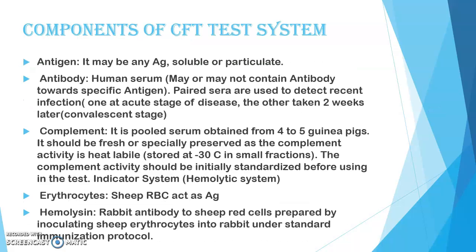Components of the CFT test system. Here are some components. Antigen: it may be any antigen, soluble or particulate. Antibody: human serum. Paired sera are used to detect recent infections.